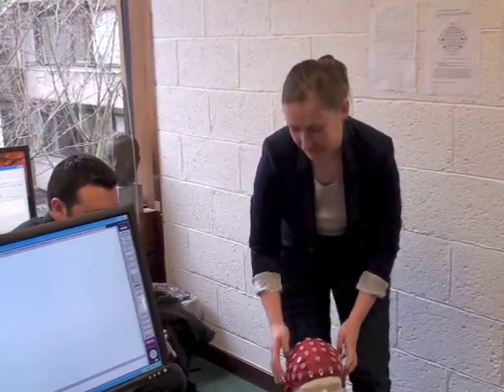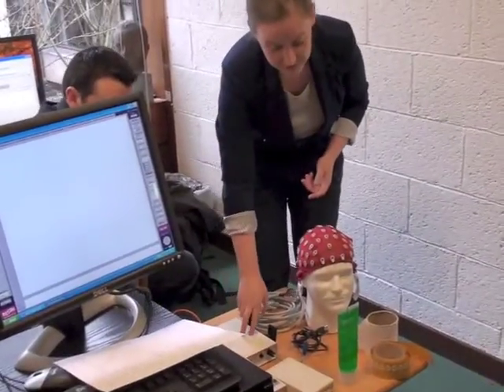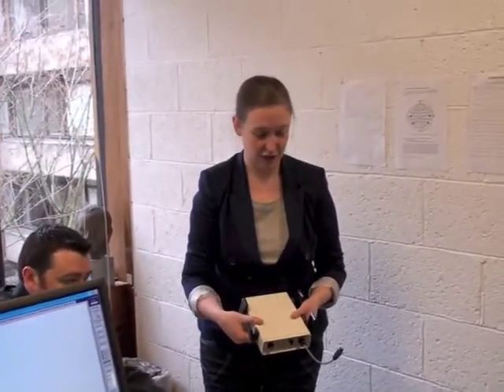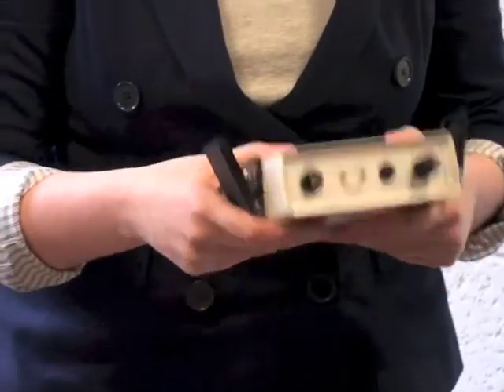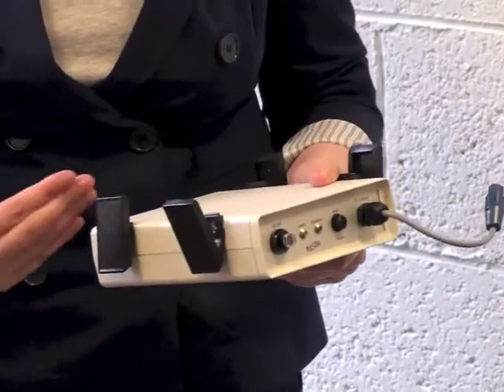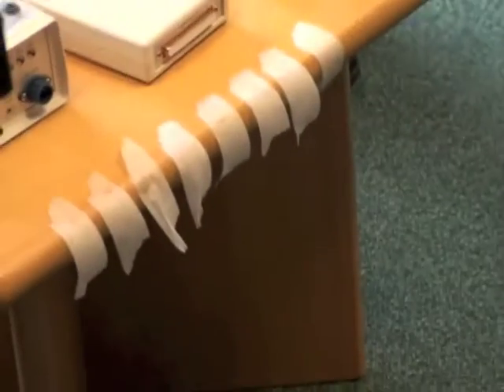Okay, right. The 3 pieces of equipment, and again, I would have set this up just before the participant came in, but I wanted to show you how to use it. This is the battery that powers the EEG. There's 2 batteries, and there's a spare one over there. If one is running low, and it will tell you it's running low by blinking, take it away and use the other one, because it will run out very quickly. And remember, the experiments can be over an hour long, so if this runs out in the middle of your testing, you're dead.